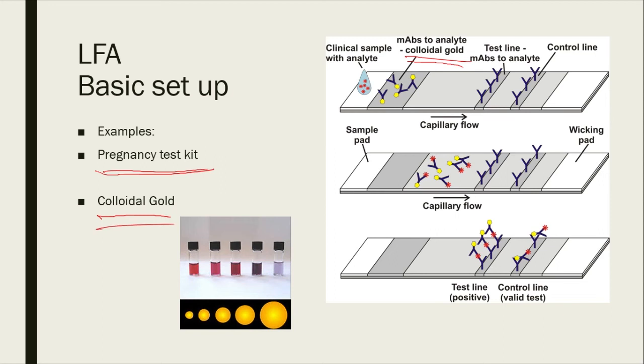Here is an example. Basically, it's a suspension of gold nanoparticles in solution. Gold nanoparticle is not golden colored. The smaller gold nanoparticles, 15 to below 50 nanometers in diameter, have a more pinkish red color, and as the particle size gets bigger, it gives you a more blue-purple color. It ties into a different concept called localized surface plasmon resonance. I don't want to bombard you with this great detail. Just take it as a fact that gold nanoparticle is not gold in color. It's pink to bluish purple depending on the size.